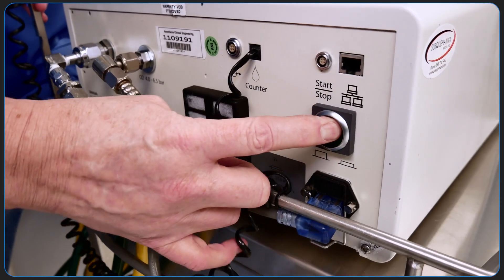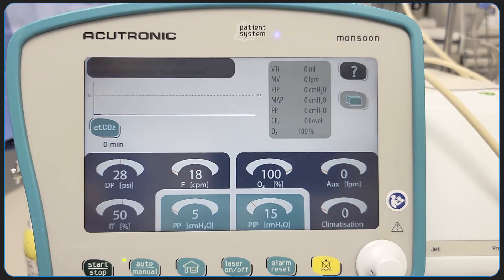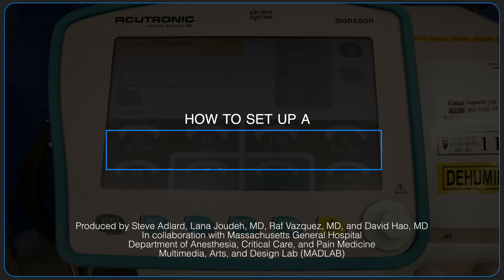To turn the machine off, press the start-stop button on the back of the machine. You will hear an alarm and a blue alarm message will appear as confirmation. To confirm, press the yellow alarm mute button and the apparatus will power off.